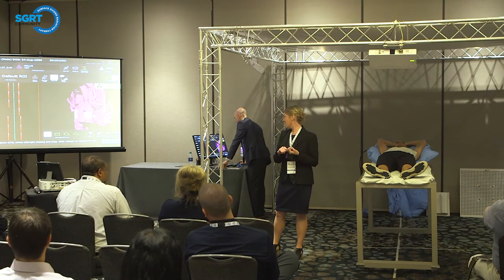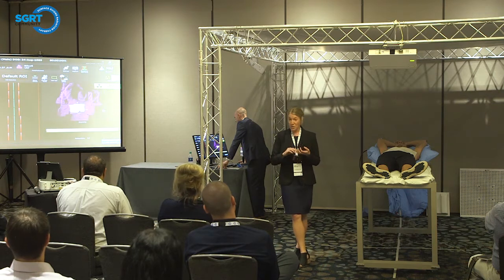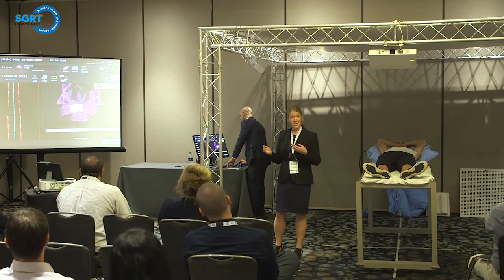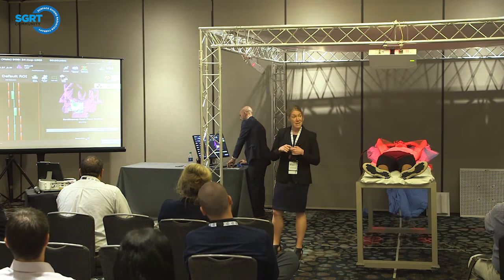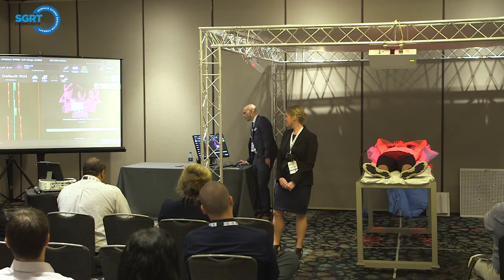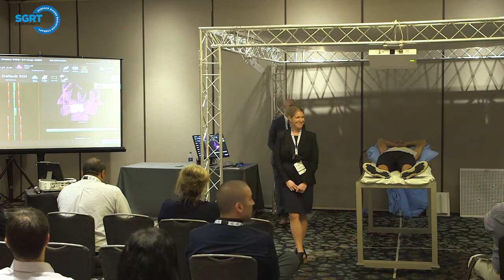Okay, so I will say, if at this process you forget to add your reference here, that's when I would look at my frame rate, and I would notice my frame rate being 1 or below, and the system will be very slow to update. So that's my cue to know that I forgot to draw the ROI. And now the system is trying to align the entire patient there and not just focus on the treatment site. Okay, great. Any questions on bolus?